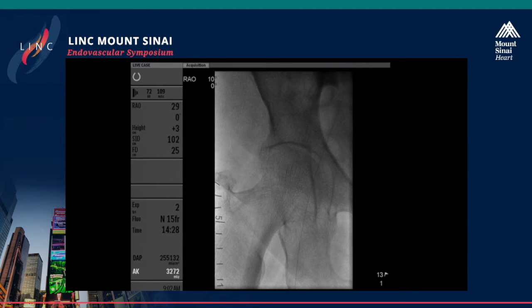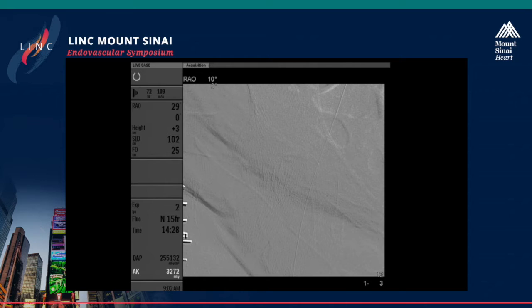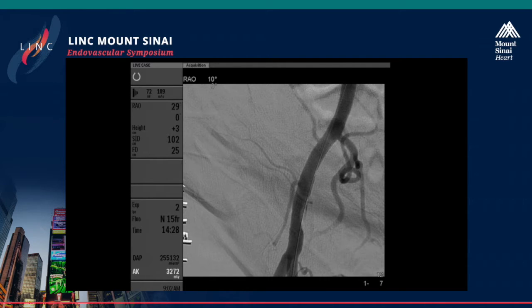I think bifurcation involvement forces your hand to possibly consider surgery more. But with today's technology, that's why it's important for Dr. Deleuze and Dr. Malik to tell us the surgical perspective, whether this is a rational approach if we avoid putting in a metallic implant, or maybe that's not even a criterion here, to get this open. So that's one of the reasons why we wanted to really discuss this.